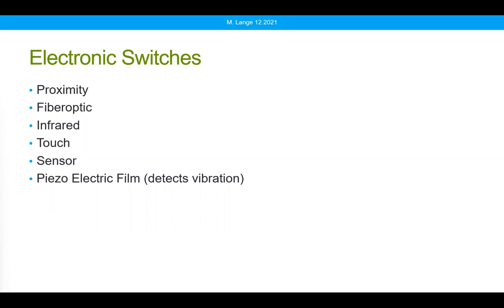Some communication devices also have some auditory feedback options where when you hit that switch and the scan starts, you might hear a noise. I'm not sure how much you can turn the volume up on that feedback on each communication device, but that might also be helpful.